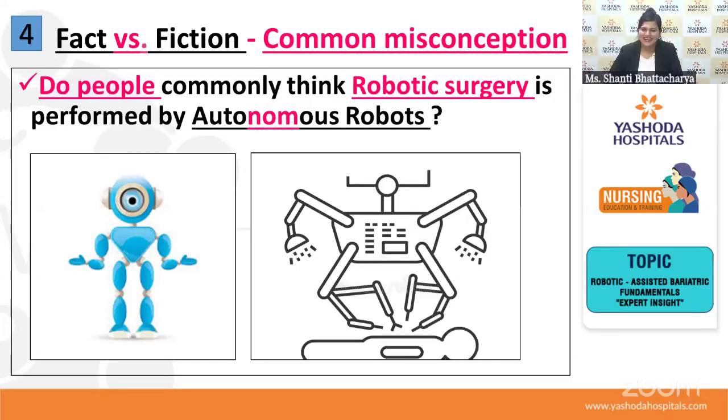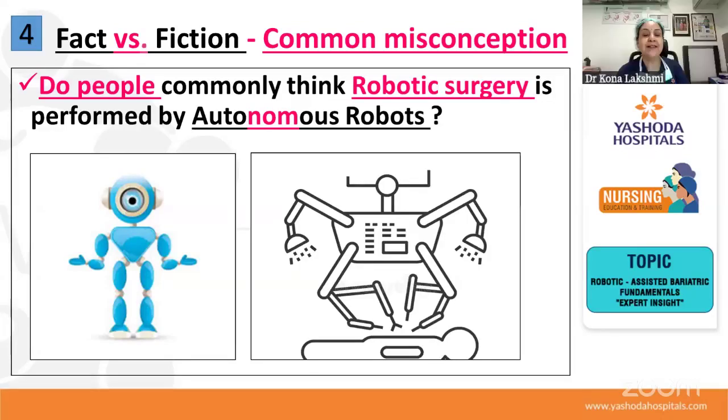I only have to do the surgery, and this is a more advanced tool that is helping me to do whatever surgeries I'm recommending to you in a better way. So I give them some comparisons, like driving a manual car and an automatic car. You see, now in an automatic car, one pedal and everything gets adjusted. But in a manual car, you have to think 10 times. Which is the clutch, which is the gear, am I pressing on the brake or the accelerator? You think so many things.